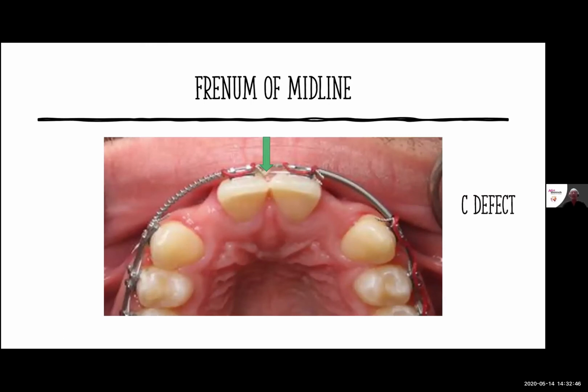We can take on a patient that we're using in the cosmetic area. I typically like to make my initial incision right in the frenum itself. By doing that, I'm giving them a little bit of a frenectomy, but I'm also going to hide my scar a little bit better. And so I like to come into the frenum in this area, and then after I've done this, I'm going to begin tunneling through this C defect back to the extent of this tooth right here, the canine. And then from my initial incision right here, I'm going to tunnel through this and then back around and underneath the C defect and get back onto good bone itself.